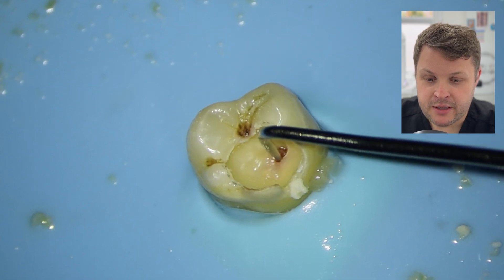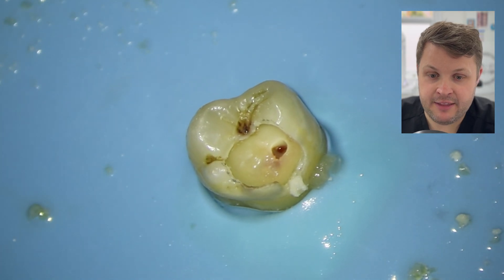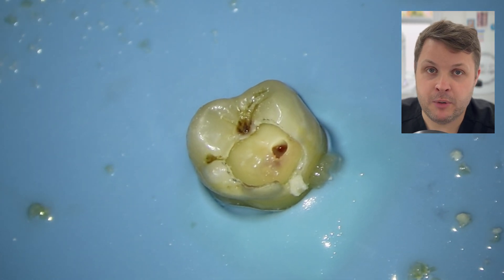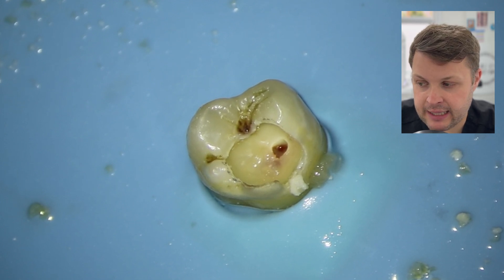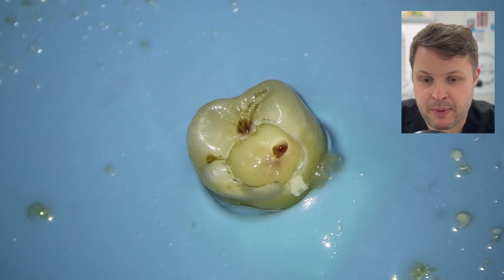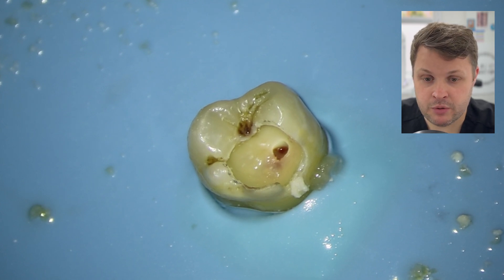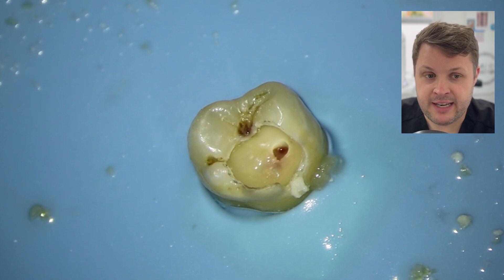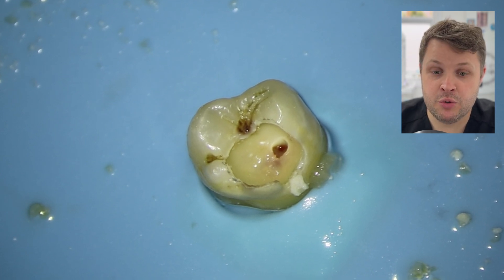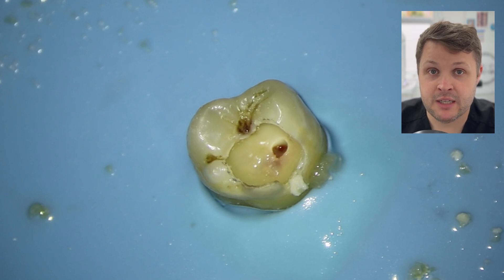Now, there's a massive debate about dressing teeth. Some people would say that you would need to remove the pulpal roof and really, really give it a clean out. I would say in some cases I will do that, especially if the tooth is completely necrotic. So if I were to remove the pulpal roof and there was no pulp at all, then I would make sure I get inside the tooth and give it a clean out. But in this case, the tooth is partially vital — the tooth is irreversibly inflamed, but it's partially vital.